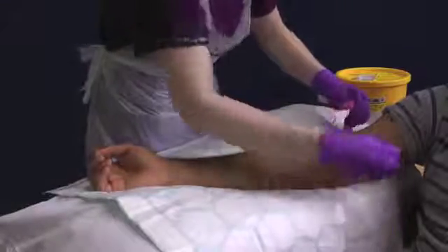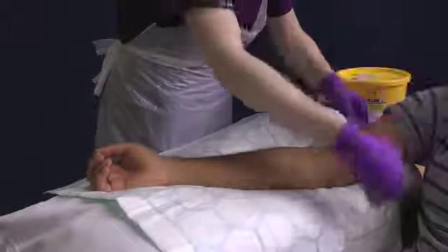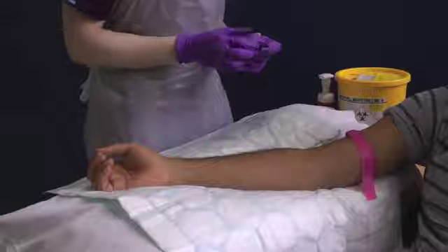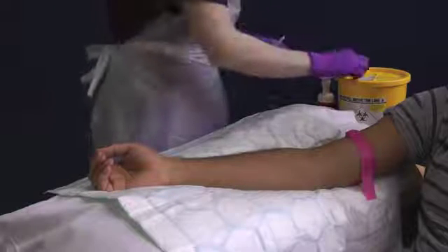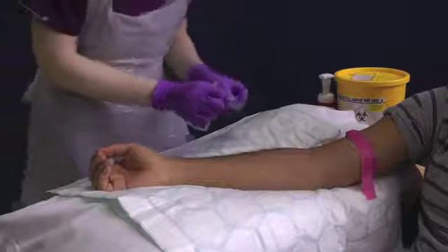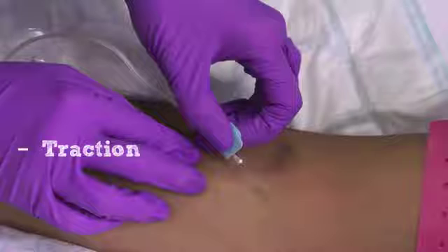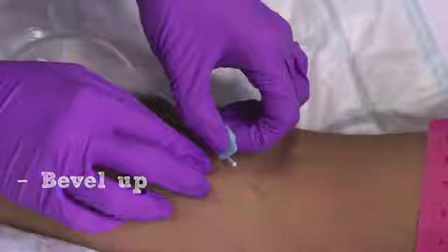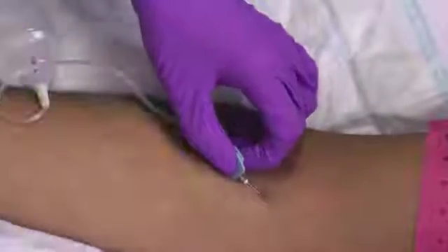Reapply your tourniquet to distend the vein. Do not repalpate the cleaned area of skin. Take your collection set and remove the plastic sheath from the winged needle. Apply traction below and to the side of the proposed puncture site to help immobilize the vein. Advance the needle bevel up into the vein. Once the needle has punctured the vein, you can release the traction on the patient's arm.